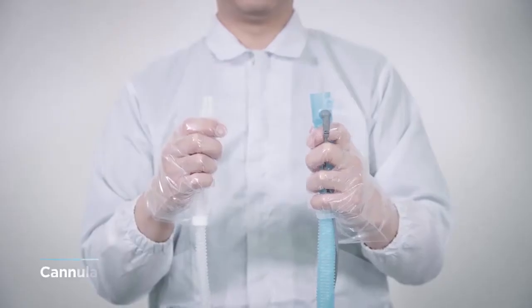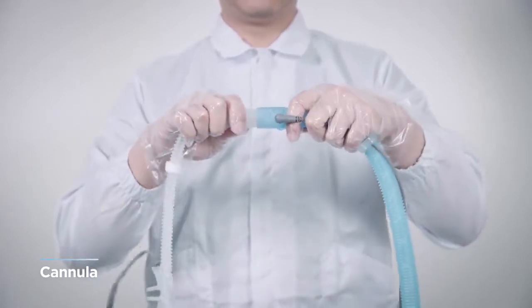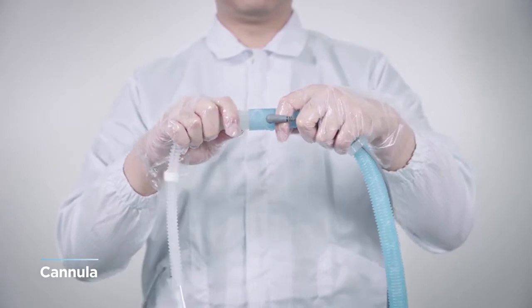Prepare a cannula to connect to the patient in advance. Considering the nasal size of the patient, select the right size and connect it to the circuit.